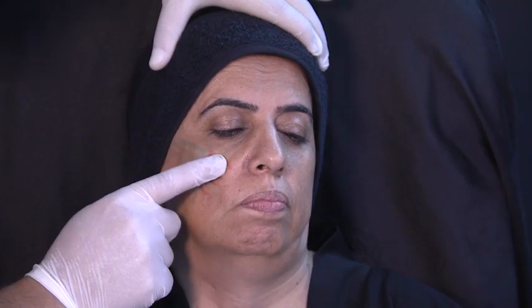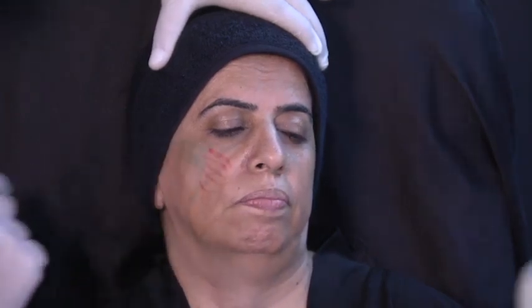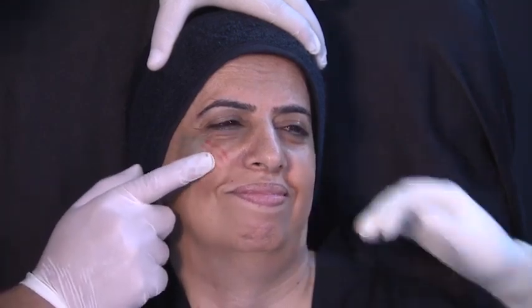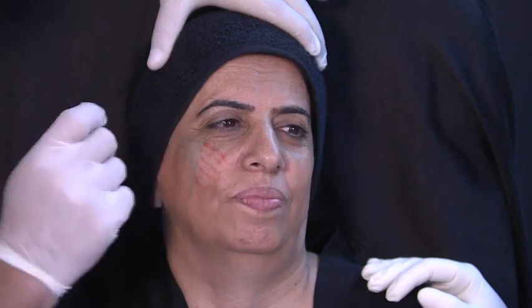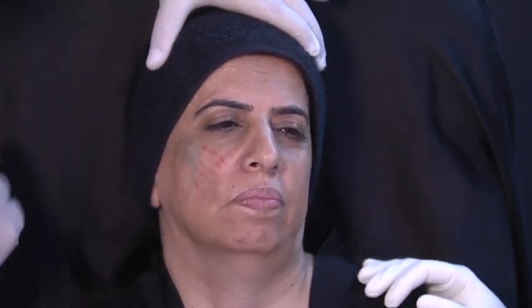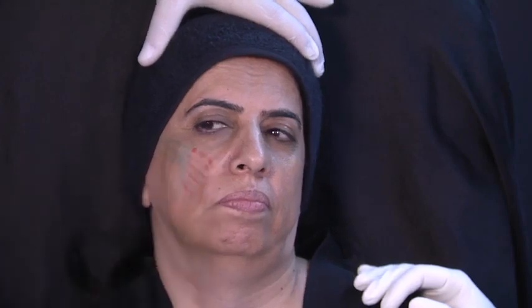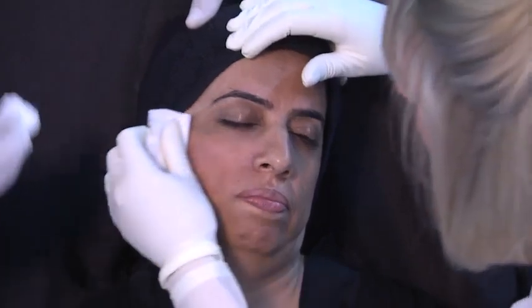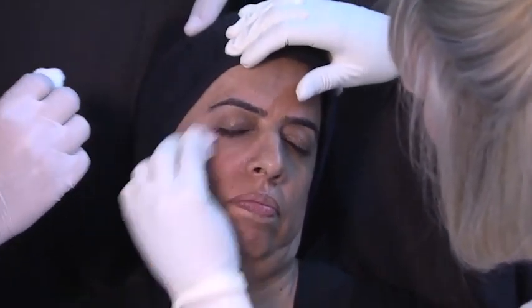And I am also going to do a double layer treatment. Because when we have a patient like this, if all the product that we inject is in the deep layer, we will need a lot of product. If we combine the deep layers and the superficial layers, the superficial fat pads, then we will need a little bit less and she will have a better result in terms of hydration of the skin, luminosity, and also improving the very fine wrinkles when she smiles.